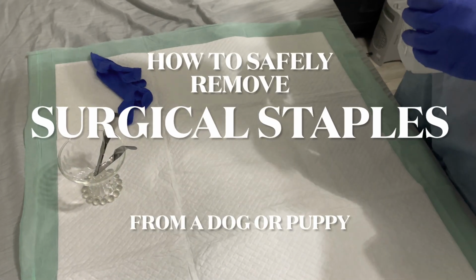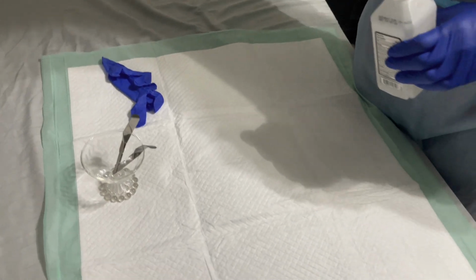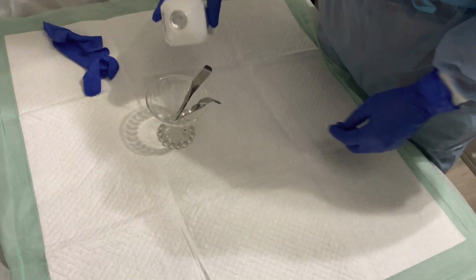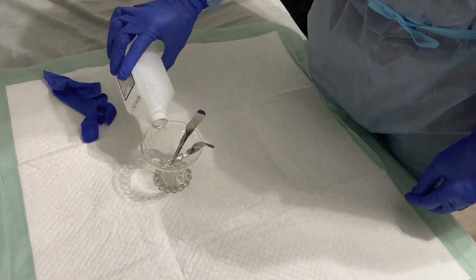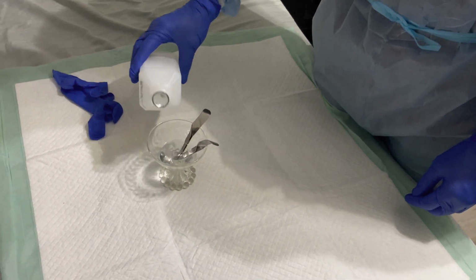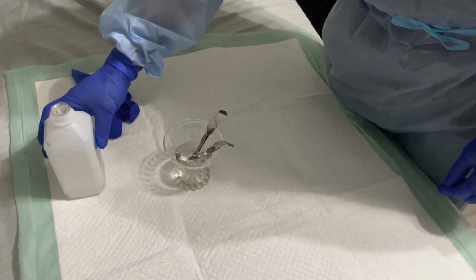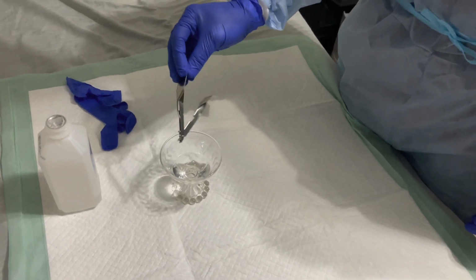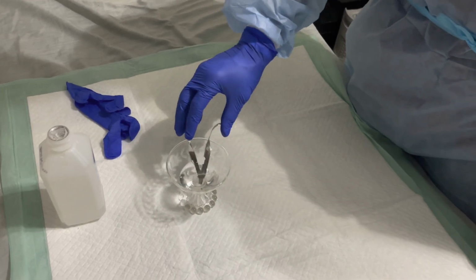Show how we take out staples basically from anywhere, but today we're going to be taking it out from a Doberman pinscher's tail. So you're going to need a staple remover. These are made by 3M. You can get these on Amazon, look online.